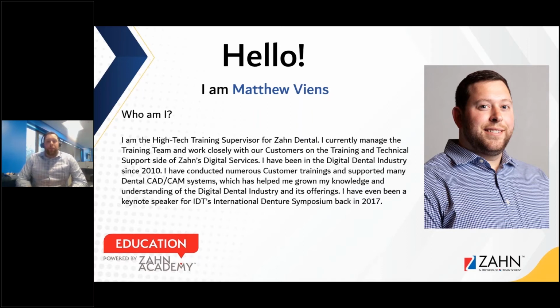So just a brief background on myself. I started with CAP back in 2010 and gained my knowledge and experience through the digital side as well as the traditional lab workflows from CAP's production standpoint. From there, I went up through the ranks and started teaching and providing technical support and services for the digital equipment that we were handling in-house as well.